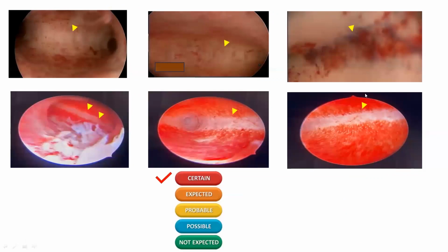During diagnostic hysteroscopy, we were used to comment on the endometrial cavity and cervical canal as regarding if you find any pathology or not, or abnormal vasculature. But during the work, I observed that the fundus of some women is irregular in some cases, and this irregularity is delicate and fine. And mostly it's between the tubal ostia or the Darwish triads, and sometimes extending a few millimeters to the lateral pelvic walls.